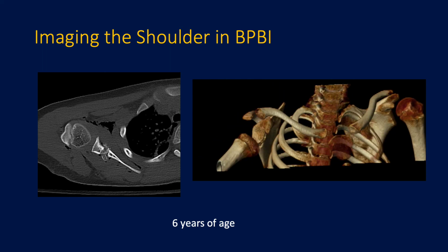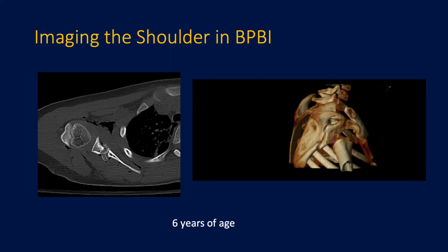CT has a role in evaluating the shoulder in older children who are being considered for reconstructive surgery of the scapula and glenoid or tendon and nerve transfers.